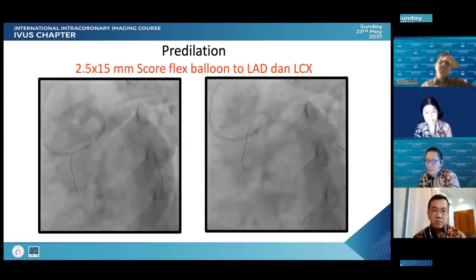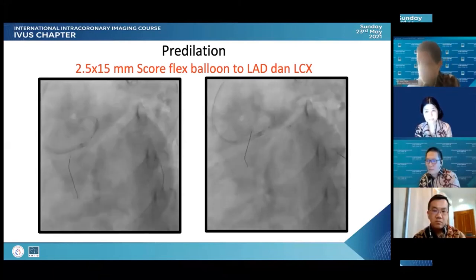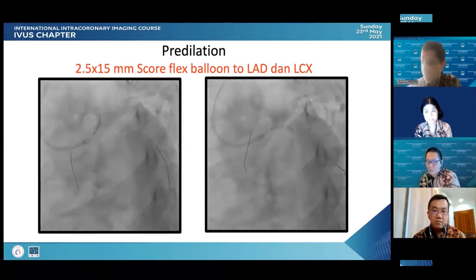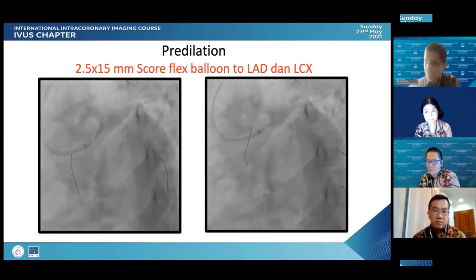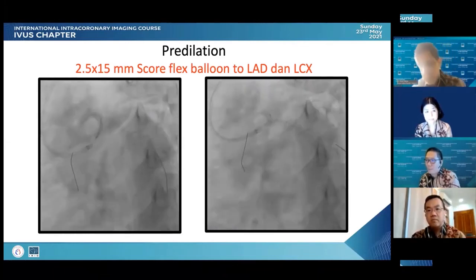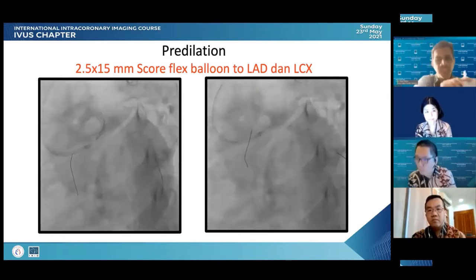Yeah. Even in the PREPARE-CALC trial, a large percentage of the patients who had rotational atherectomy actually had post-dilatation afterward with scoring balloons or cutting balloons. I think it was up to nearly 30%, if I remember correctly.